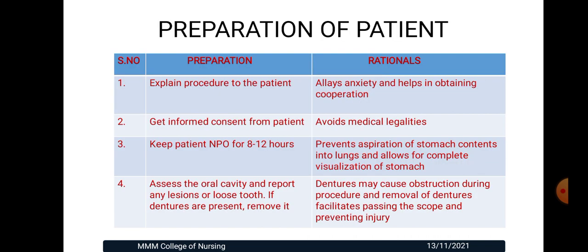Preparation of patient. First, you have to explain the procedure to the patient. Some of the rationale are allays anxiety and helps in obtaining cooperation, and get informed consent from patients, avoids medical legalities, and keep the patient NPO for 8 to 12 hours. Some of the rationale are prevents aspiration of stomach contents into lungs and allows for complete visualization of the stomach.